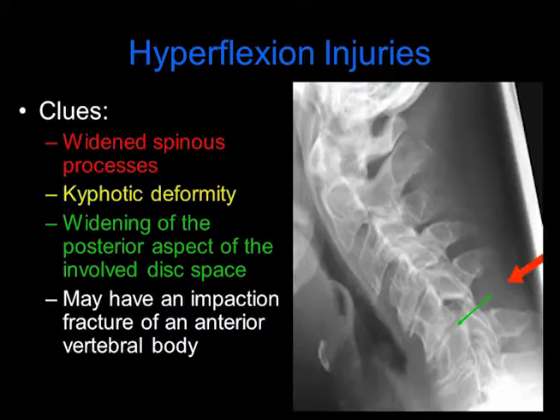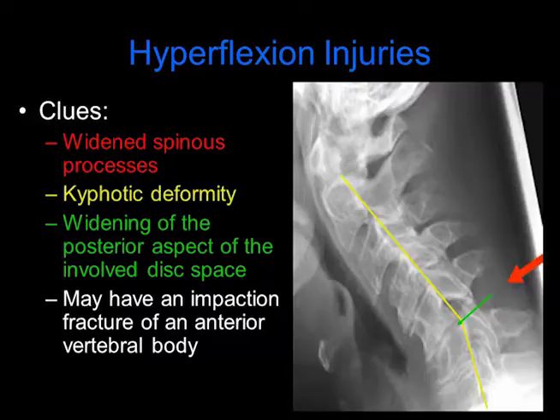Hyperflexion injuries are common injuries, especially with motor vehicle accidents. Clues include widened spinous processes, as we can see on this radiograph with the red arrow, kyphotic deformity, which we can see here with the yellow lines, as well as widening of the posterior aspect of the involved disc space as we see with the green line. There may be an associated impaction fracture of an anterior vertebral body.